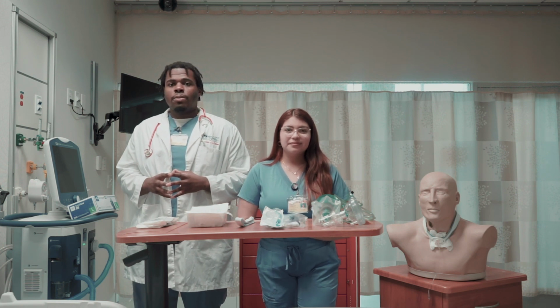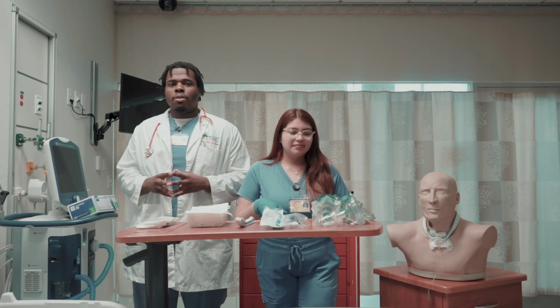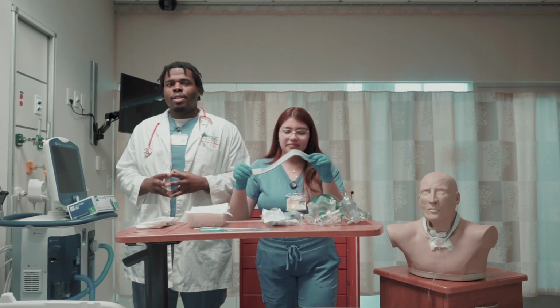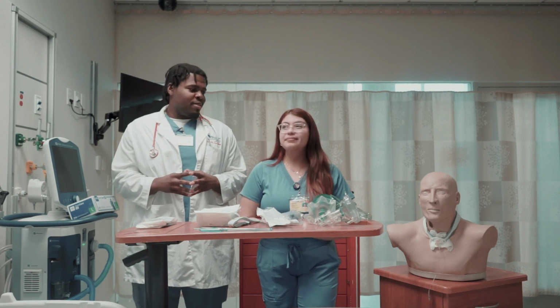The first thing you want to do is confirm the physician's orders. After confirming the physician's orders, you want to gather all the necessary equipment needed for this procedure, which includes a BVM, suction equipment, tracheostomy tie, tracheostomy care kit, and sterile gloves. Thank you, Michelle.